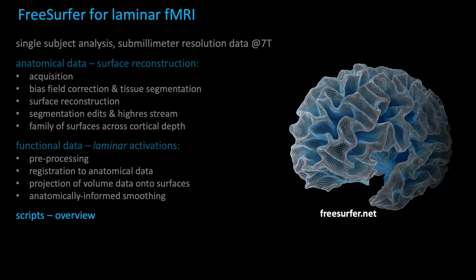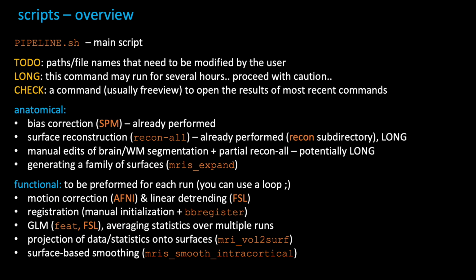All right, so that was it in terms of the background. Now I'm just going to quickly show you what we'll be doing tomorrow, if you choose to learn a little bit more about the FreeSurfer approach. So I prepared this pipeline script. It's a shell script which contains most of the commands that we've been talking about and that you can test tomorrow. There are 3 different tags there.